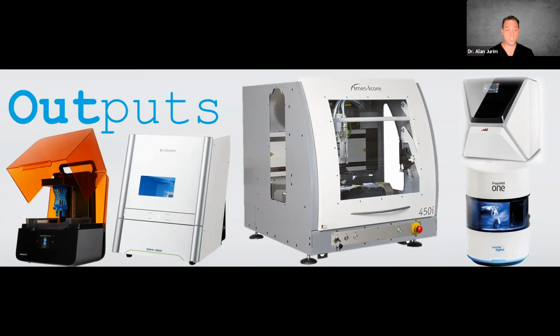And the reason why is because there's a lot more complexity with milling and manufacturing with milling machines than there is with 3D printing. And I'm going to give a couple of examples of this throughout the presentation, but just keep in mind the real important part to this is that printing tends to be a lot simpler to get your final product than with what milling does. And these are the two major categories that we have of our outputs in digital dentistry.